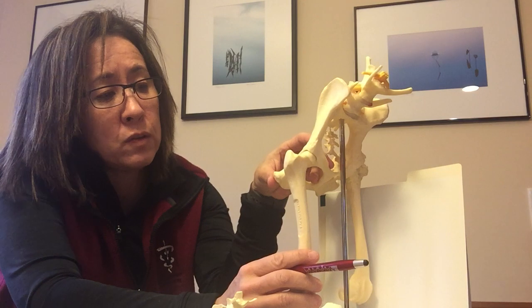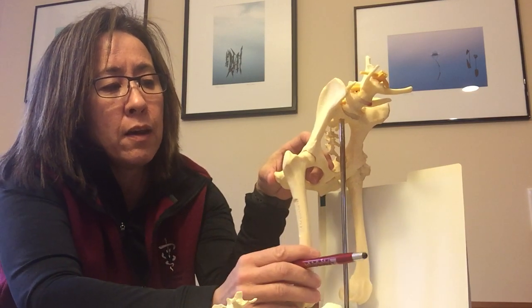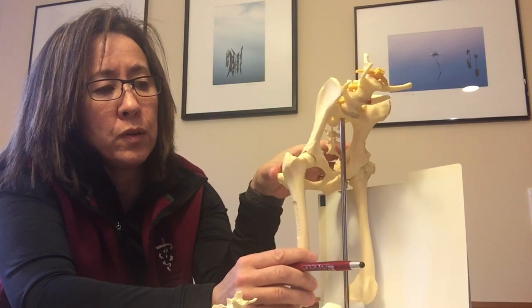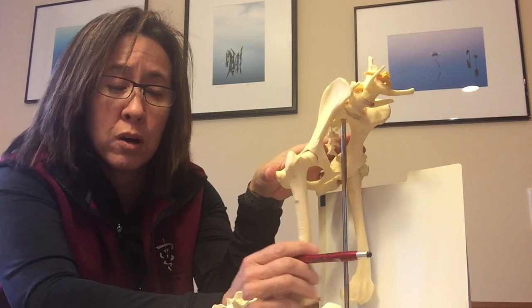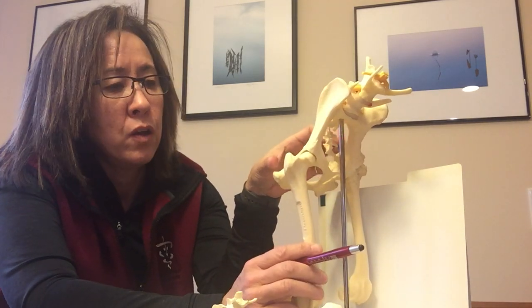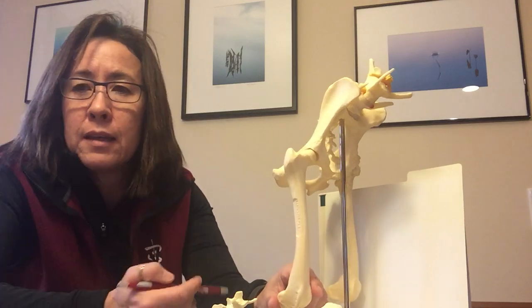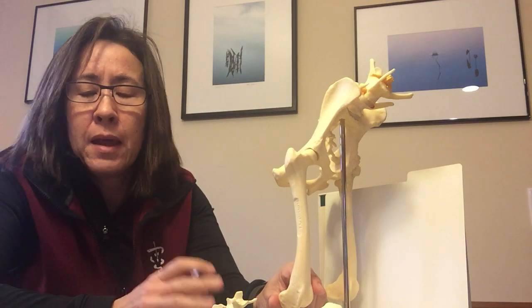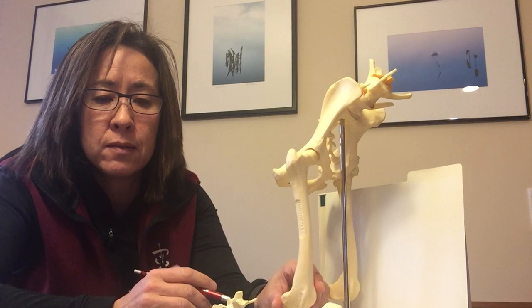If your dog has loose hips — meaning instead of sitting nice and snugly in there it's bouncing around and moving — what you're going to do is destroy that cartilage and develop osteoarthritis. This laxity is something that needs to be measured, and this is what makes PennHIP so much more sensitive, because it can measure this laxity the best.